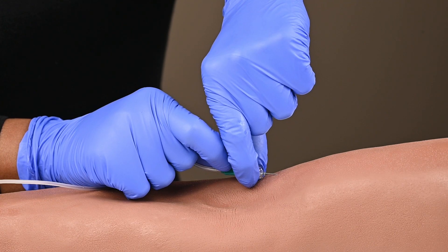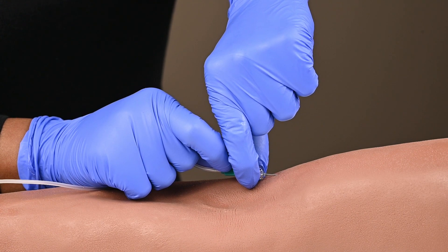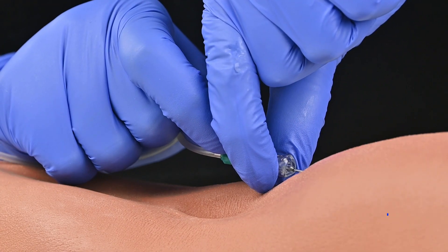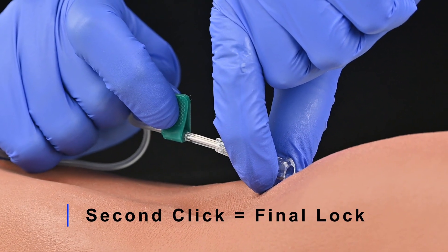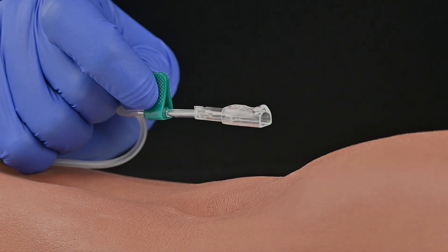No forward movement should be used. You will pull back on the wings with your dominant hand while holding the shield steady. When resistance is felt, the needle has been fully retracted. A visual inspection should be performed before disposal.